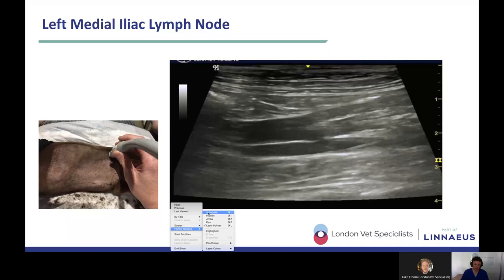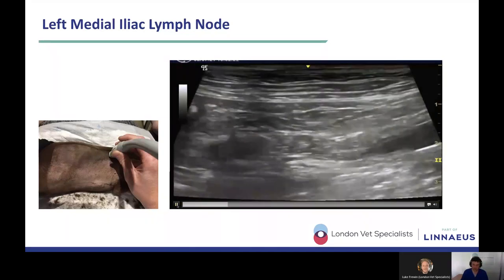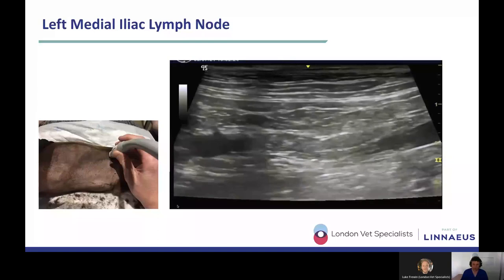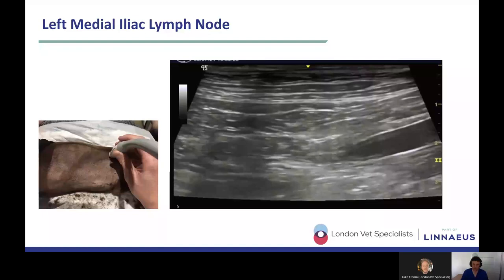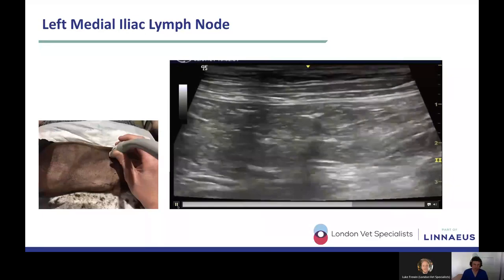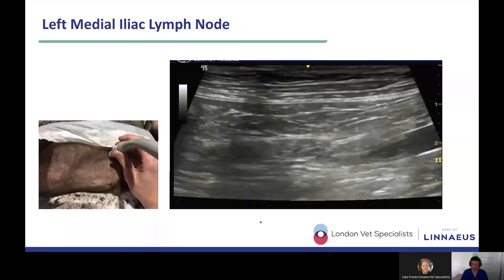So let's see if we can find the medial iliac. So here I've got the aorta, the aortic bifurcation. We can see the external iliac arteries extending beyond the bifurcation. We're just looking for a structure just next to it. And in this dog, because they're normal, they're kind of hard to see. But if you just look very carefully, you can see that there's a little sausage-shaped structure just here that most likely represents the left medial iliac lymph node. And there's another one just adjacent to it, which is probably the internal iliac lymph node.